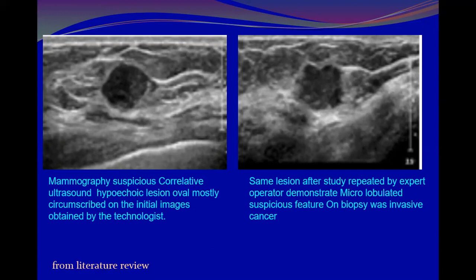Mammography showed a suspicious lesion, evaluated by a less expert ultrasound technologist obtaining this lesion. If you give it the highest grade, you will give it 4B.